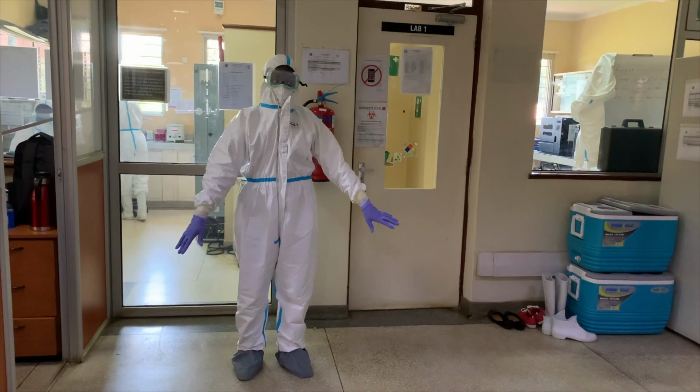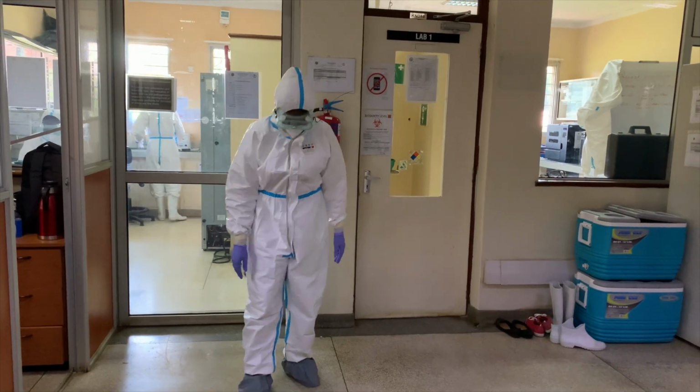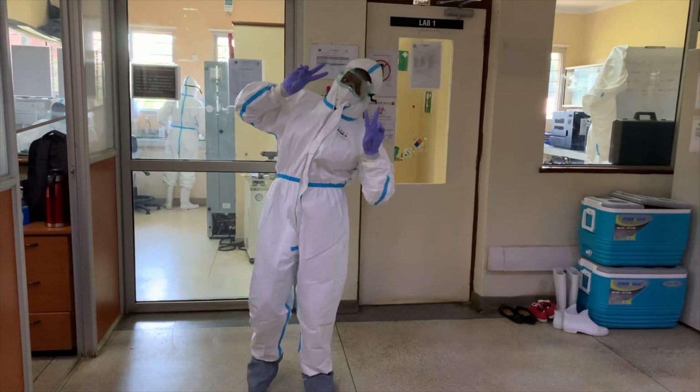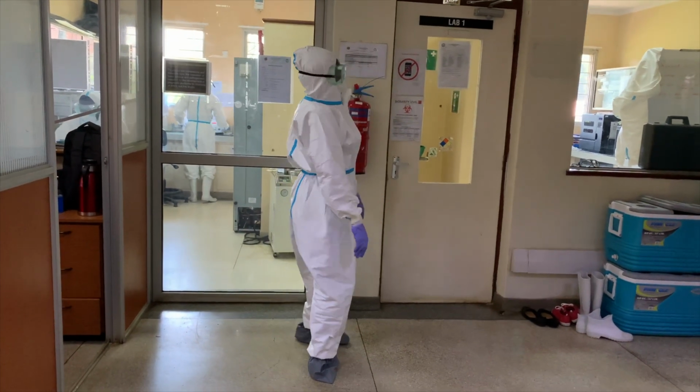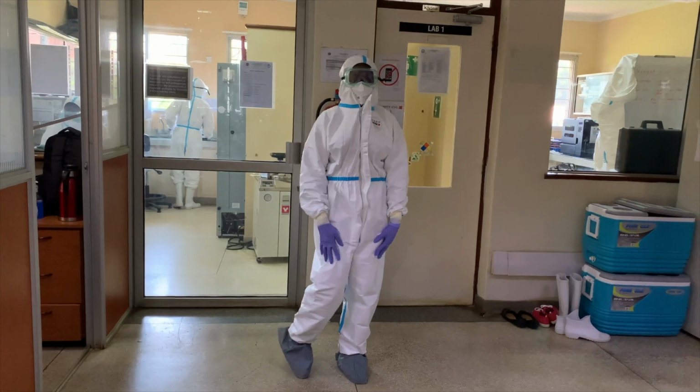Okay, so the first thing they have to do is sample collection. But before you collect the sample, since we know that this virus is highly infectious, the health worker who collects this sample definitely has to protect himself or herself. So basically, we put on the Tyvek suit. You have to wear the whole thing, and then you put on your glasses, and then an N95 mask, and then the whole face shield, because you don't want any part of your body exposed.